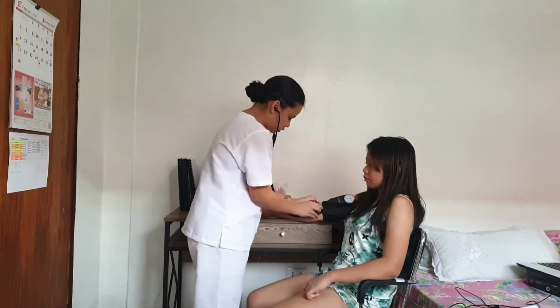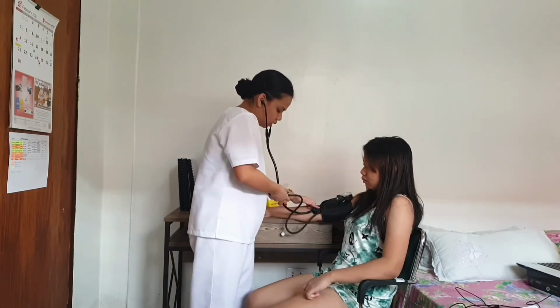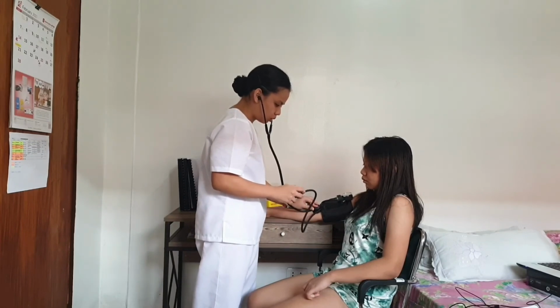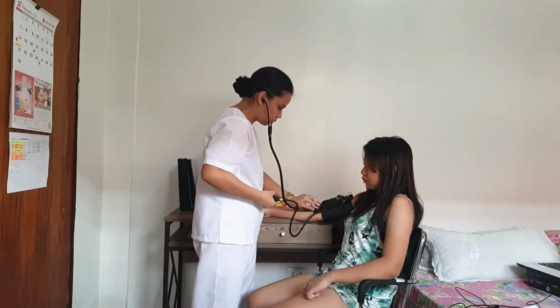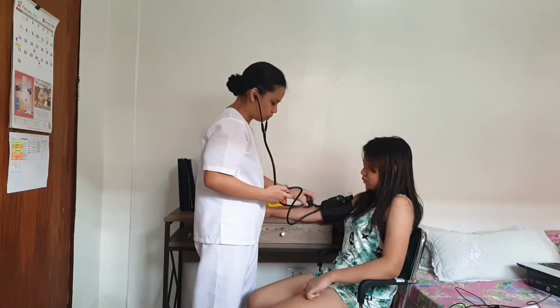I am placing my stethoscope on her brachial artery so that while I get her blood pressure, I will hear the diastolic and systolic. Be sure that it is closed. So from my measurement, it is 90/70, and to be sure, I will repeat it again.